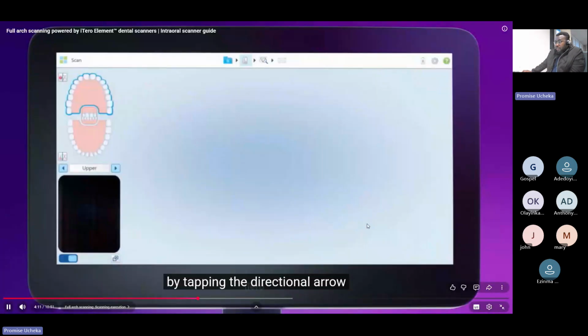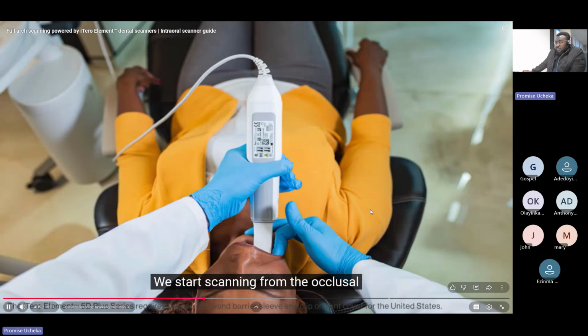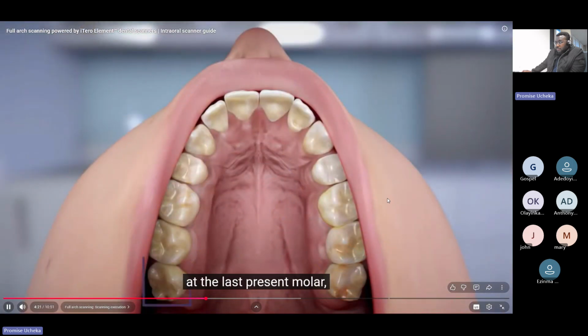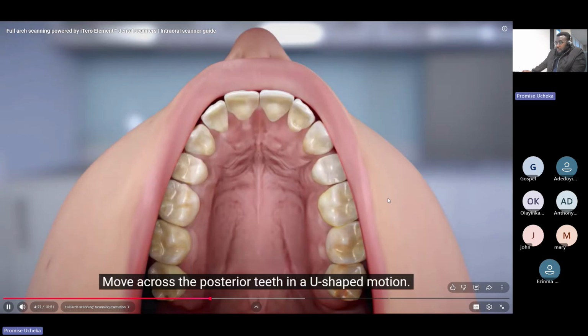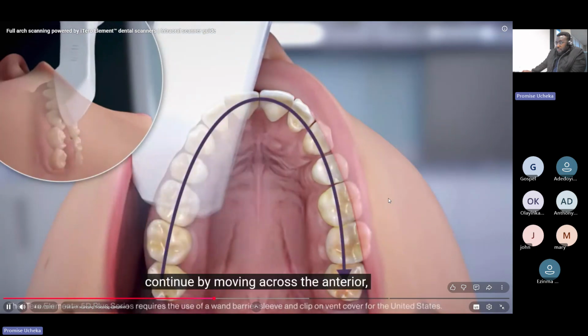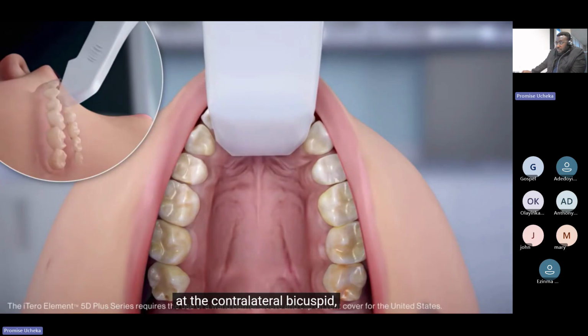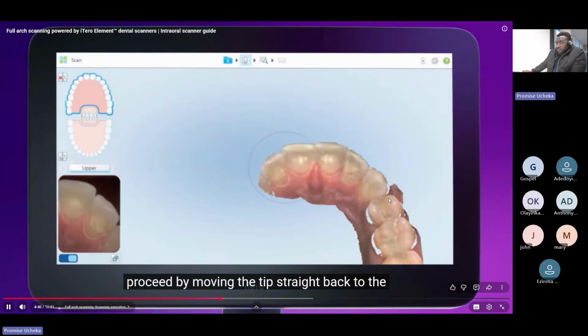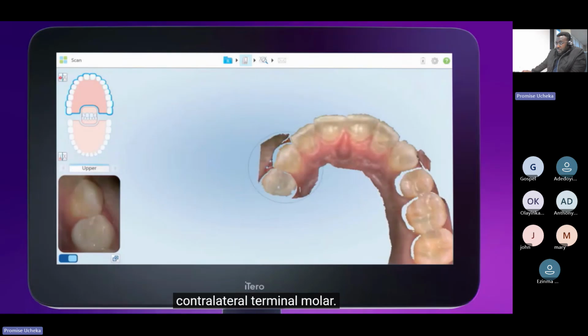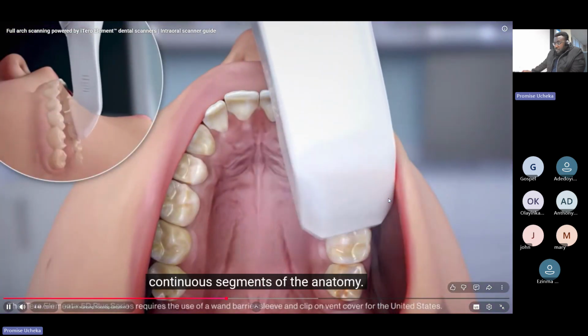Now we will switch segments by tapping the directional arrow to switch to the upper arch and scan with the same protocol. We start scanning from the occlusal at the last present molar, and in this case is a wisdom tooth. Move across the posterior teeth in a U-shaped motion. When you reach the bicuspid, continue by moving across the anterior, tilting slightly to the lingual at the contralateral bicuspid, and then proceed by moving the tip straight back to the contralateral terminal molar. This will allow the capturing of continuous segments of the anatomy.